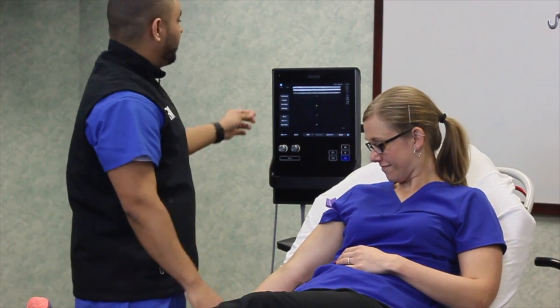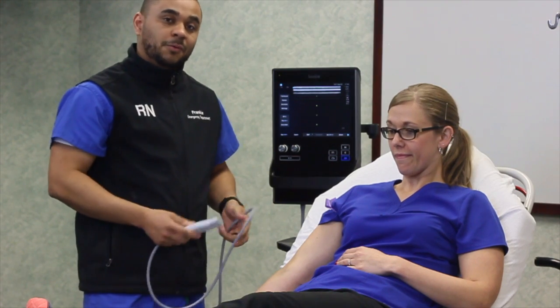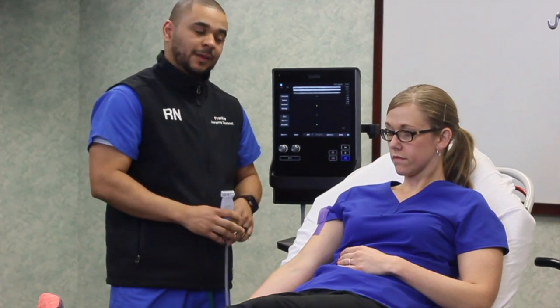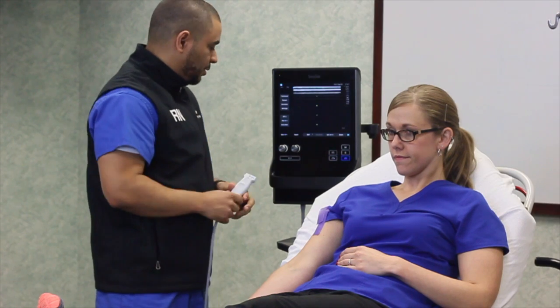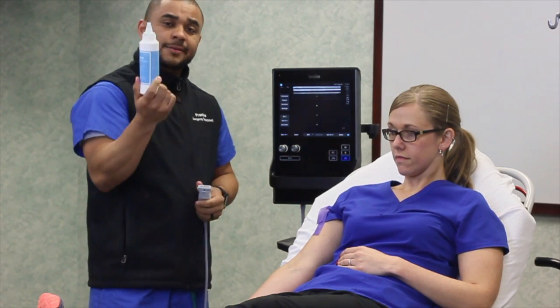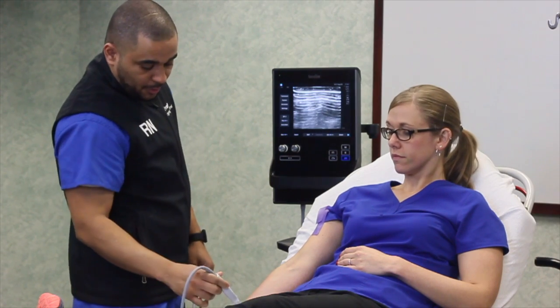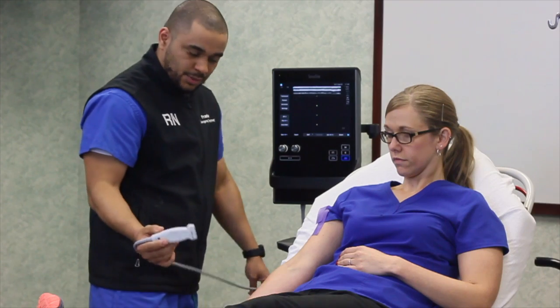It's important to talk about positioning of the machine — it's specific to you and whatever you feel comfortable with. My preference is to have the machine at the same angle as my vision so I don't have to move my head back and forth. Apply the multi-use gel for inspection of the upper extremity, and start from the bottom, or the more distal part, and work your way up, just like you learned in nursing school.